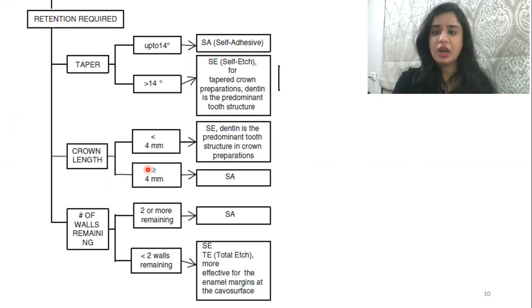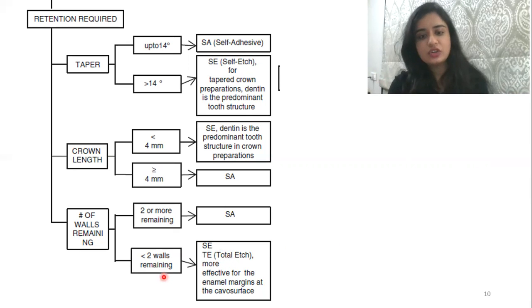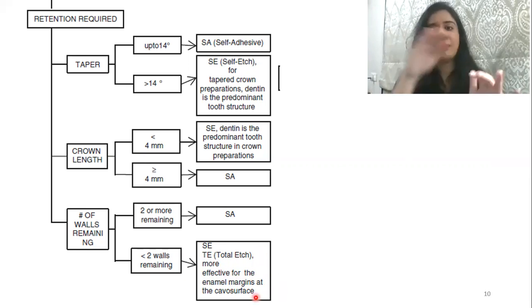Now we are talking about crown length. If it is less than 4 millimeters, again self-etch, since dentin is the predominant structure, and greater than or equal to 4 mm is self-adhesive. Number of walls remaining: 2 or more remaining, self-adhesive. Less than 2 walls remaining, you can go for a self-etch or a total etch, which is more effective for the enamel margins at the cavosurface.